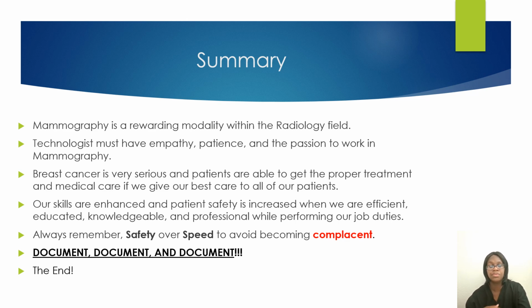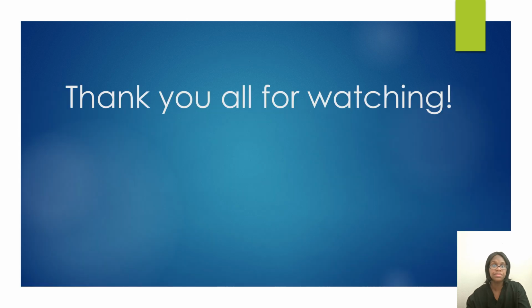It will save you in the future if someone has to look back on these notes, especially if you have any complaints. If someone comes in and they forgot which side, you have concrete notes in the system saying the patient told me this, or the patient could not perform this, or the patient could not tolerate compression. You can put all these notes in the chart.